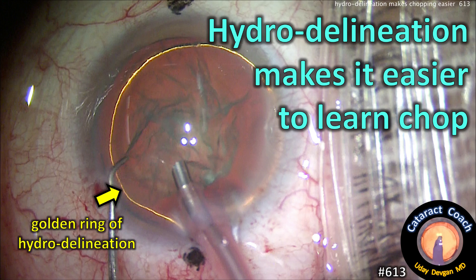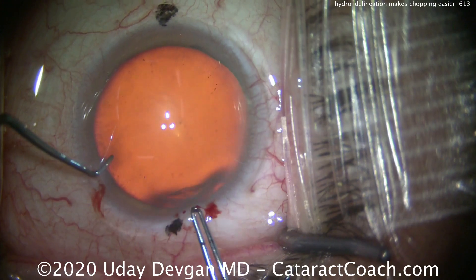CataractCoach.com. Hydrodelineation makes it easier to learn FACO chop. Here's why.